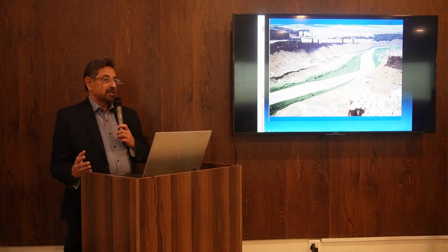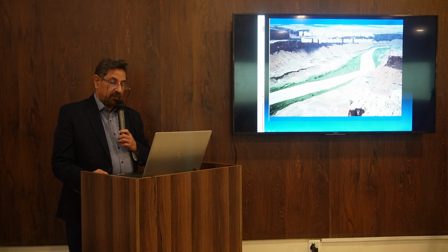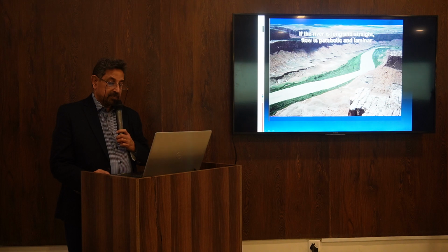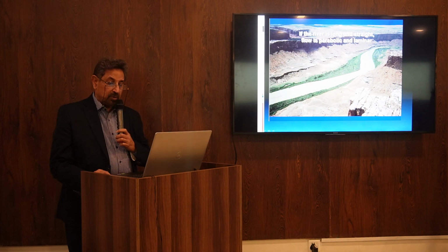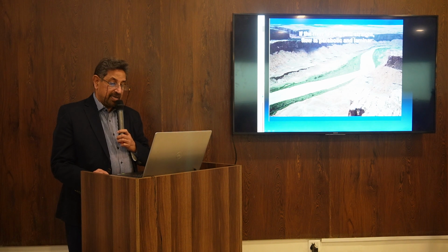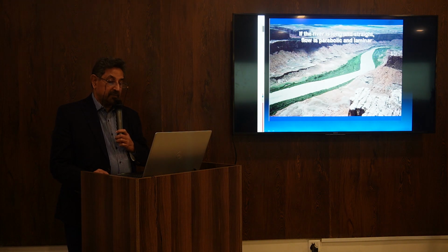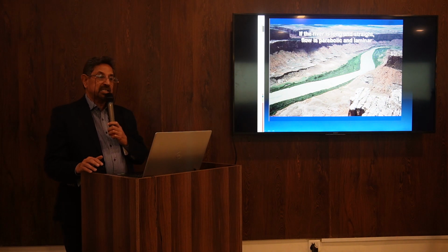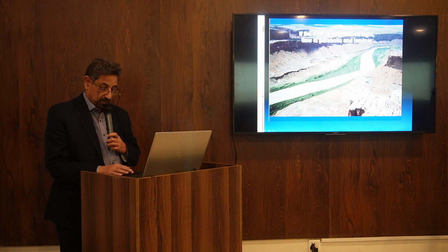In an ideal world, in a river, the central flow is the highest, and the banks of the river offer resistance to the flow, right? We know this fact. So the slowest flow will be on the periphery. In the center, it will be a laminar flow, the parabolic flow, and this is a smooth flow where the vessel does not have any plaques. No calcium plaques, no irregularity, smooth walls.